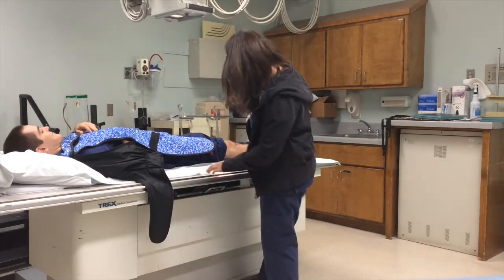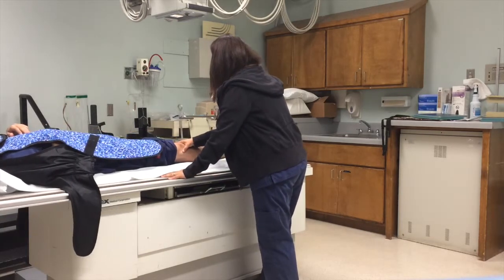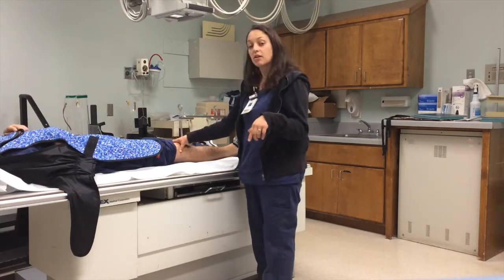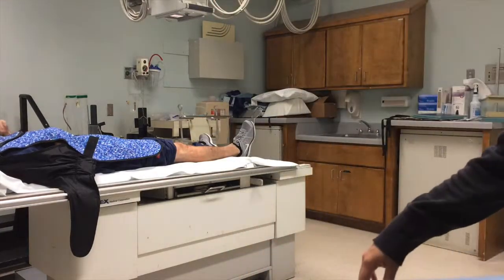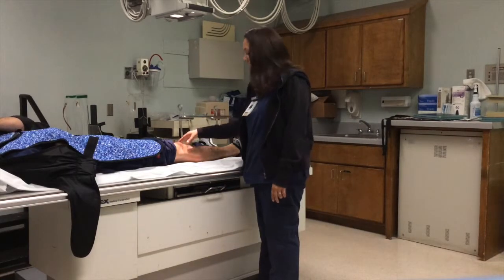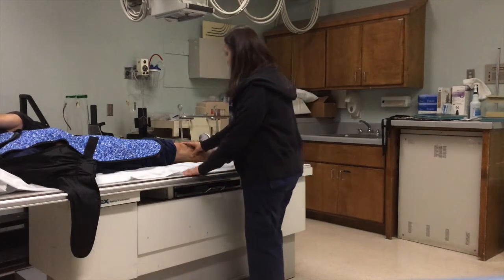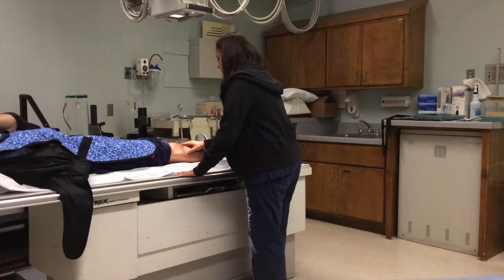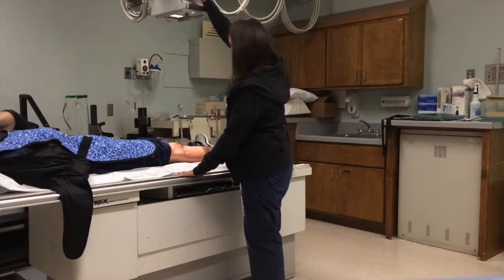I'm going to aim the center beam between the epicondyles of the femur and put it there, so you can see better. Put it between the epicondyles of the femur and then put the central ray just about a half inch below the apex of the patella. Make sure there's no rotation by feeling those epicondyles, making sure they're parallel with the table. I'm going to collimate, so it's just about 2 inches below and above.